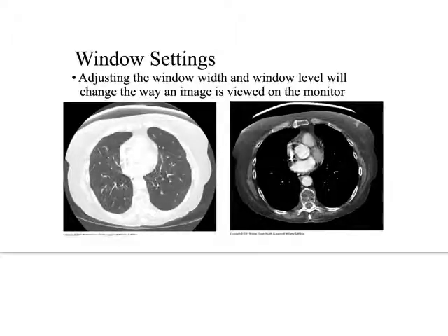And what she talks about in this textbook is because there are 2,000 different Hounsfield units, right? But most of our monitors can only show 256 shades of gray, plus the human eye can perceive even far less than that. What we're going to need to do is window and level to get all of the data that we can out of these images.